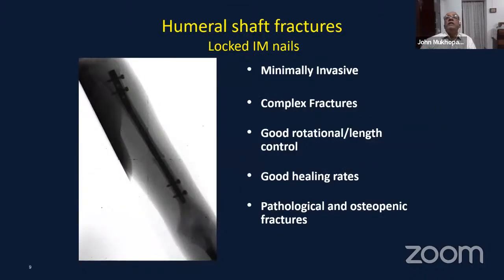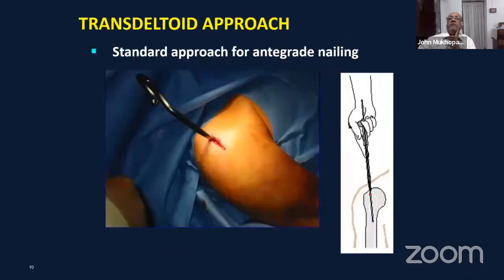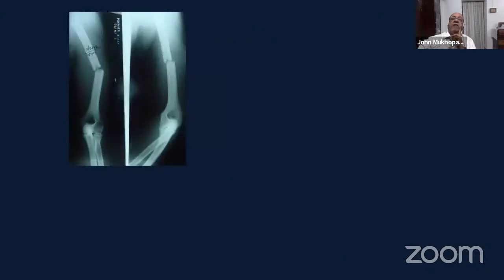The other option is a locked intramedullary nail, which is a minimally invasive treatment and is good for some of the complex fractures. You get good healing rates, however not so much in the transverse fractures, and it may be useful for pathological and osteopenic fractures. The standard approach is just lateral to the head in the region of the tuberosity, so you are going through the rotator cuff.